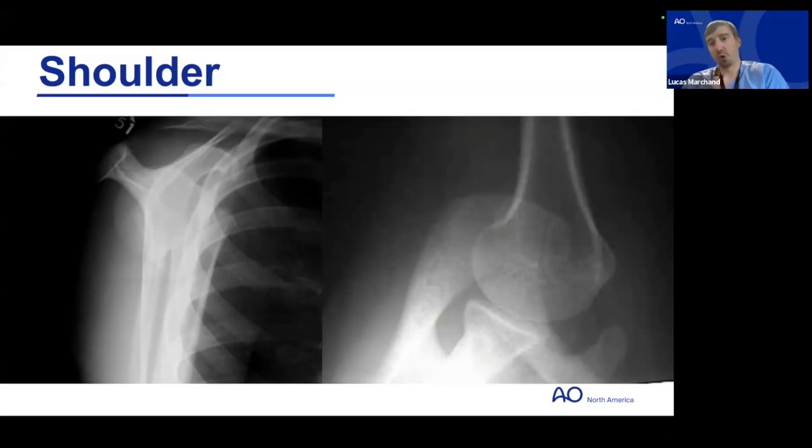So for me, if there's any concern or I'm not getting orthogonal views, to prove a joint is in a located position, we're going to go back to those orthogonal views that Dr. Kellum had mentioned. You've got to have orthogonal views, and the joint needs to be located on both of those views. That's kind of what you need for definitive proof of a joint being located.